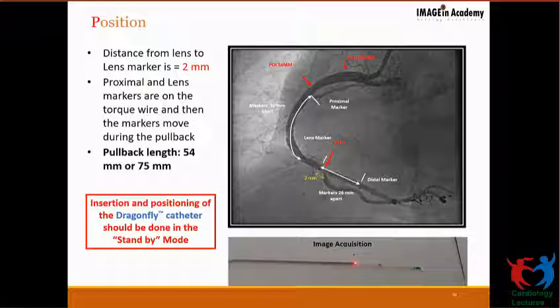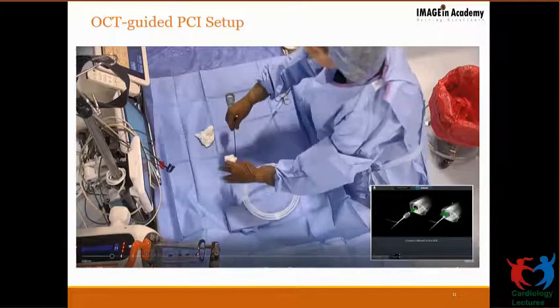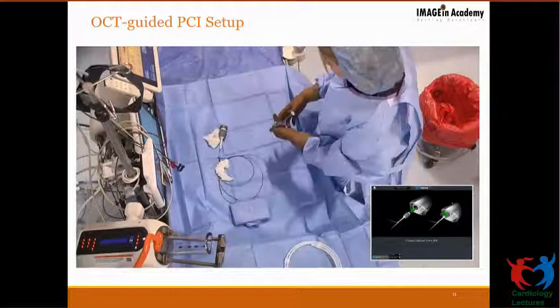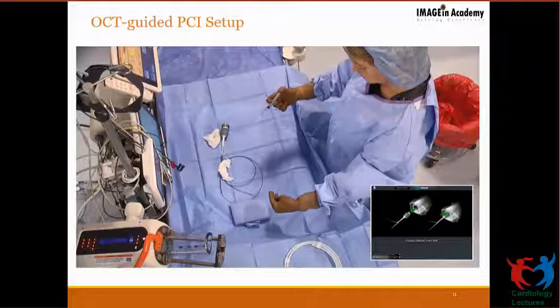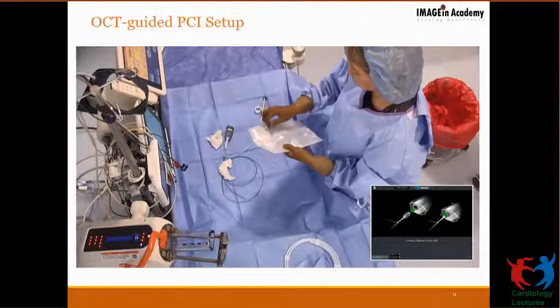This is a small video which summarizes what I have told till now. The catheter is being taken out, and a wet gauze piece is put on top to activate the hydrophilic coating. Now you can see the nurse injecting pure contrast, and at the same time she's looking for the spill of the contrast. It takes a few seconds for that to happen. Once that has happened, she's opening the packet and she'll take out a dock extension. Now, with the dock extension, you should always keep the end which has a hole towards yourself.